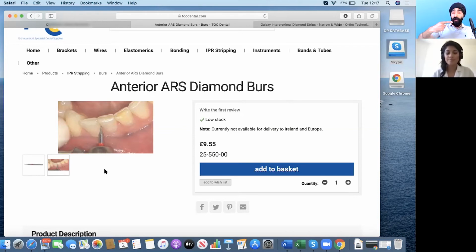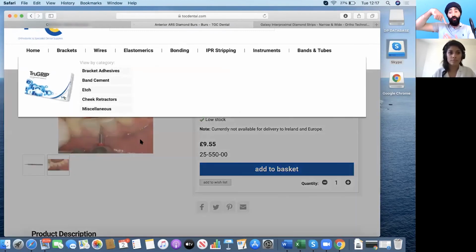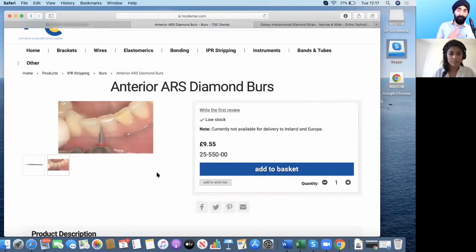Whereas others would say, no. If you do that and you slightly deviate, you make a nasty shape, a little ditch in the tooth, a negative ledge in that way. So the other way to do it would be to hold it vertically and just do little brush strokes, which is what I do 99% of the time. That's what I'm doing. Do you have a preference?